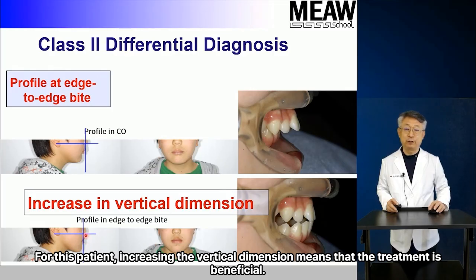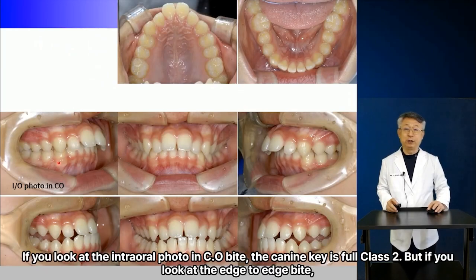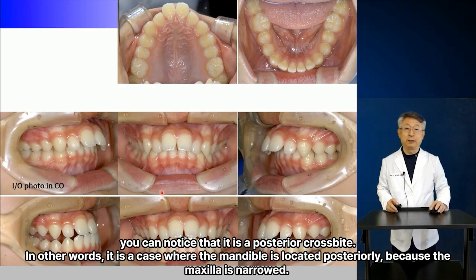This patient has an excessive overjet. If you look at the intraoral photo in CO bite, the canine key is full class 2. But if you look at the edge-to-edge bite, you can notice that it is a posterior crossbite. In other words, it is a case where the mandible is located posteriorly because the maxilla is narrowed.